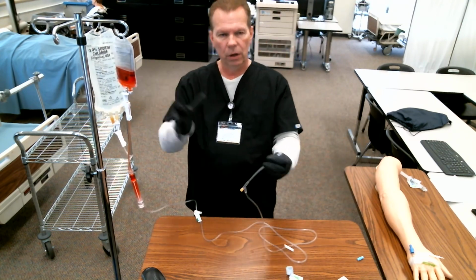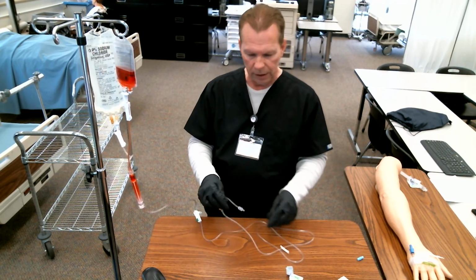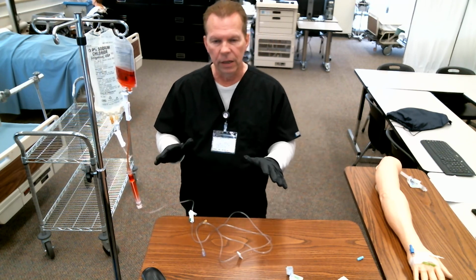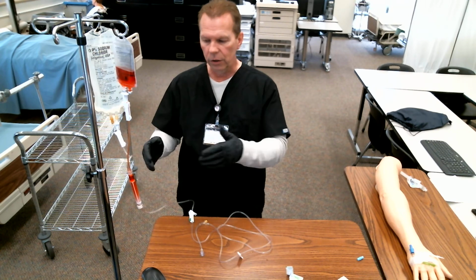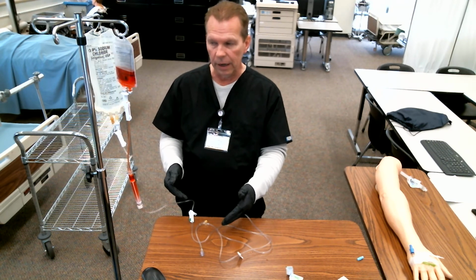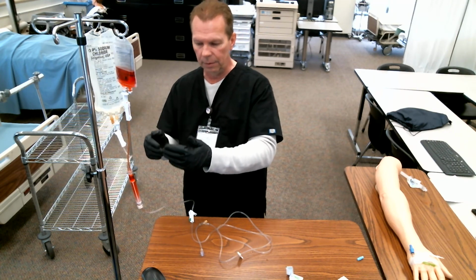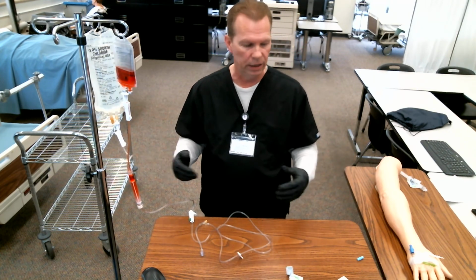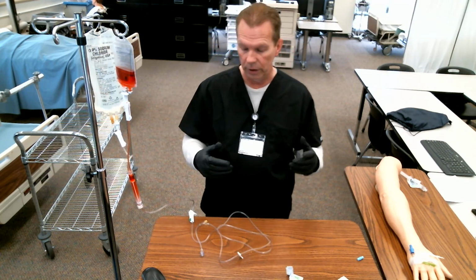All right, send the product back, and hospital policies are different. They may want the whole thing back. Where I worked, we put the whole thing in a biohazard bag and sent it back to them, and that way they kept the tubing, they kept everything. If something went wrong, you don't know, it could have been a contaminated tubing. It might not have been wrong blood. It could have been contaminated saline. It could have been anything. So they swab and check everything. But if nothing goes wrong, then they get rid of it after so many days.